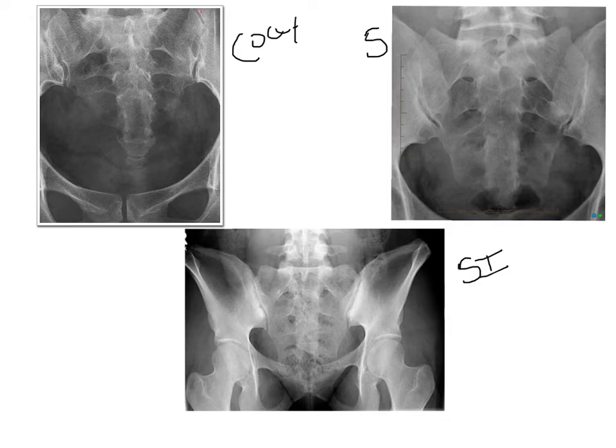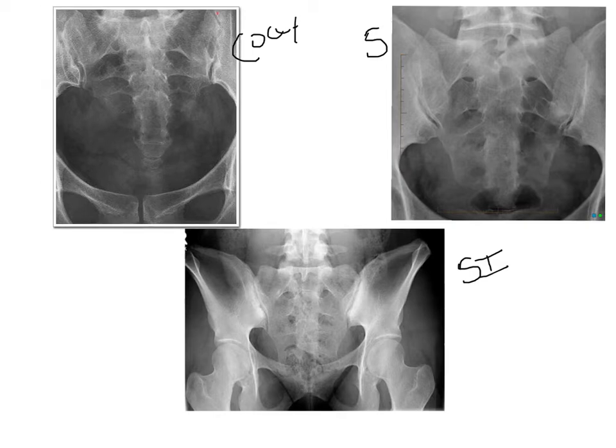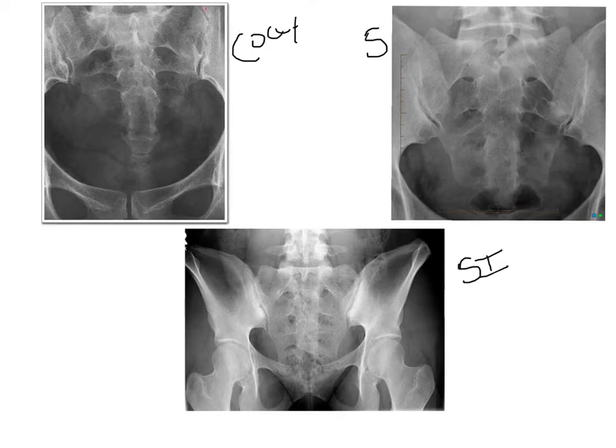Now we talked about angulation briefly, that it was tail to tail, so we're angling caudal. But how do we know whether we gave it the right amount of angulation? Well, we're still talking about the coccyx. There it is. Let me get my little pen. We should still be able to see some open joint spaces within the coccyx structure. That indicates that we have the correct angulation for this projection. If these appear closed, then we are looking at a problem of not enough angulation.